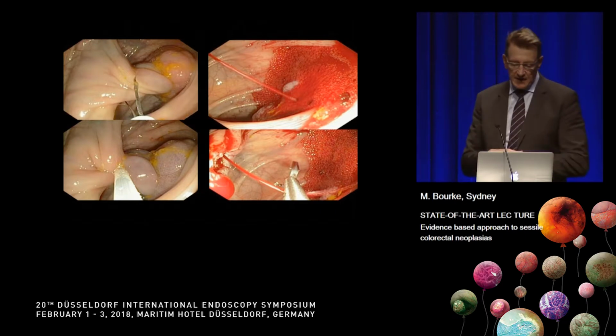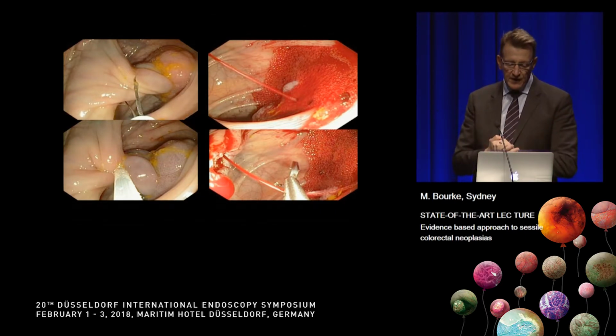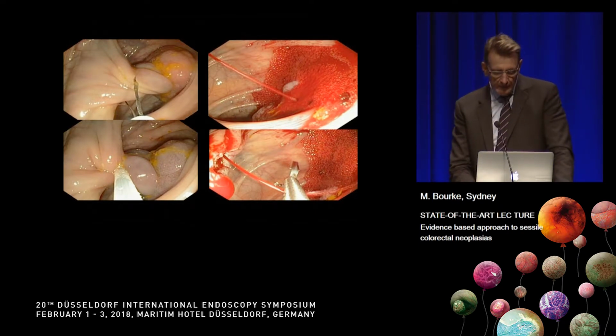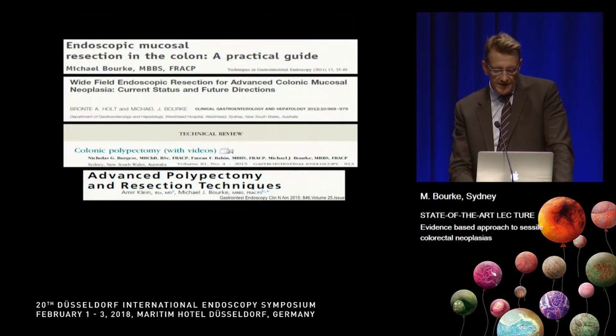So in this case, obviously a pedunculated lesion, and here we have major bleeding after we chop this off. But you know, you don't need to panic. You can take some time to take some photos. You can maybe tell a joke while they get the clip or the coag grasper, which is what we mainly use, and then you can deal with it.